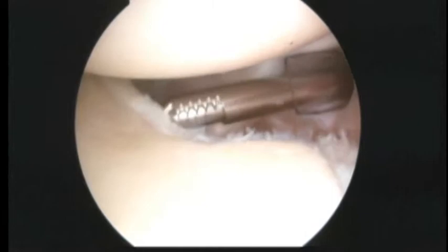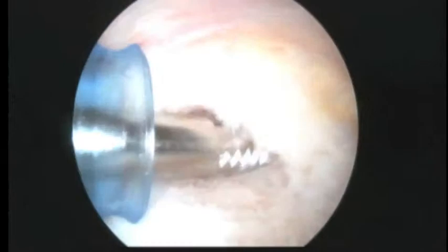So this is torn here, I think we're going to have to take that down. We're going to go ahead and finish up inside the joint. You can see we've got this labrum debrided back now. And next we're going to go ahead and get to work on the rotator cuff. And if there's any work on the bone, we'll do that as well.